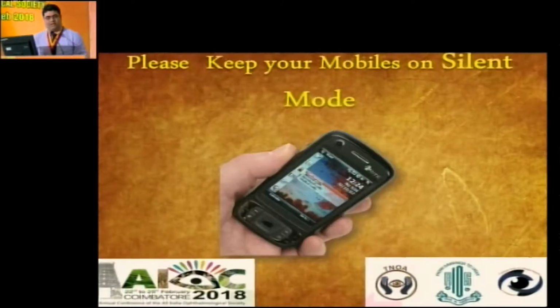We all know that posterior polar cataracts are very dangerous. They pose a significant problem to all phaco surgeons because the posterior capsule is either ruptured at the posterior pole or it's very weak, tightly adhered to the cortical layers. So there are high chances that there will be a posterior capsule defect.